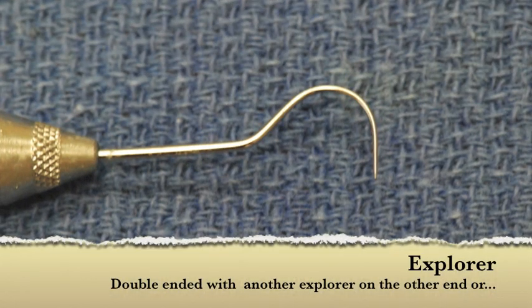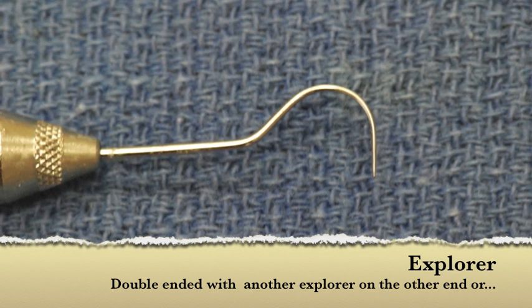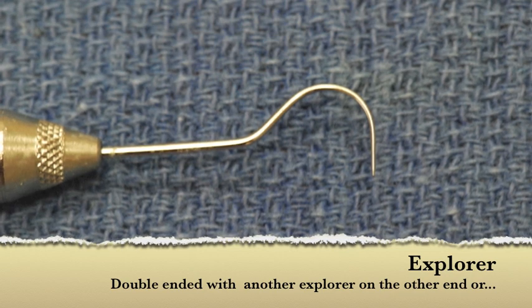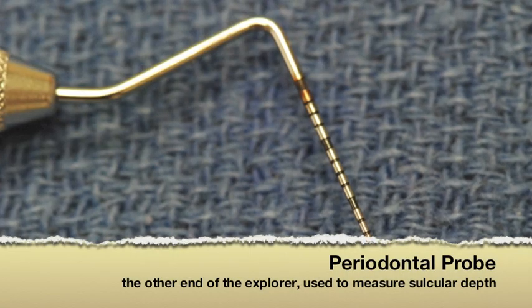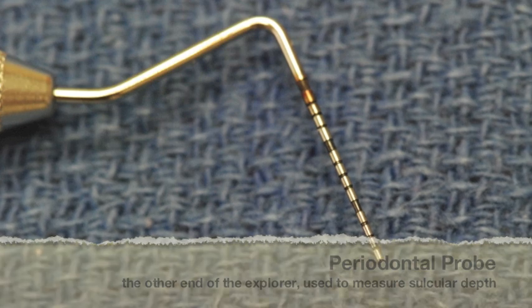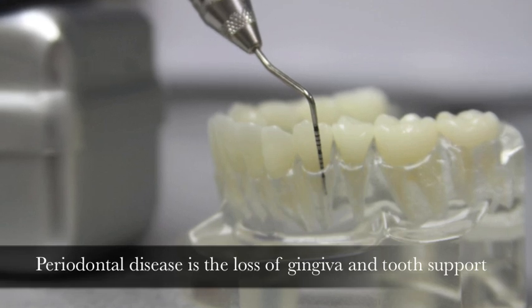This is an example of a dental explorer. This particular instrument is called a Shepherd's Hook Explorer because of its shape. This instrument is typically double-ended with either a different style explorer on the other end, or this instrument is designed to have a periodontal probe at the other end. The periodontal probe is a measuring device graduating in one millimeter increments and is designed to measure the depth of the gap between the tooth and the gingiva.